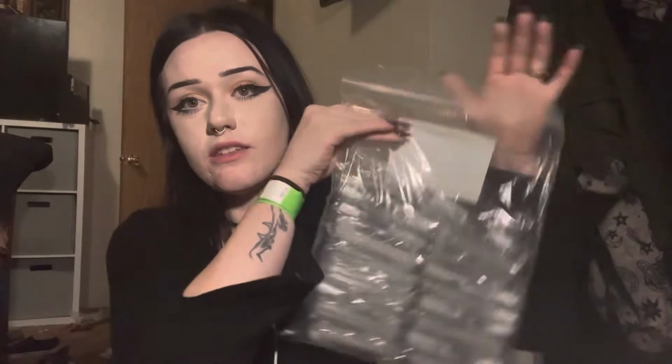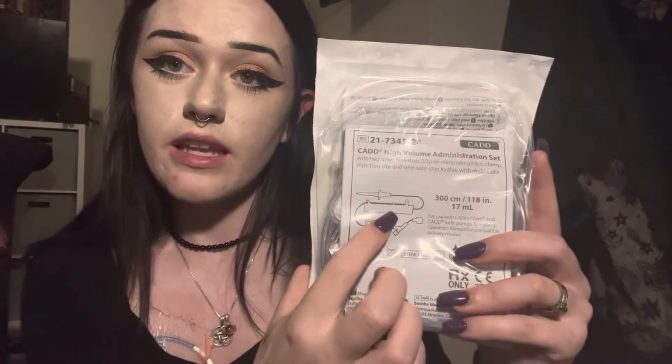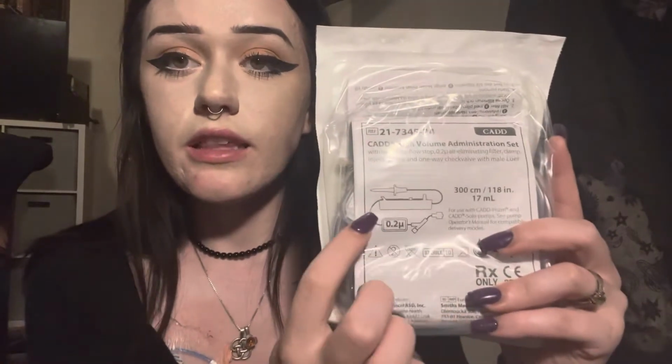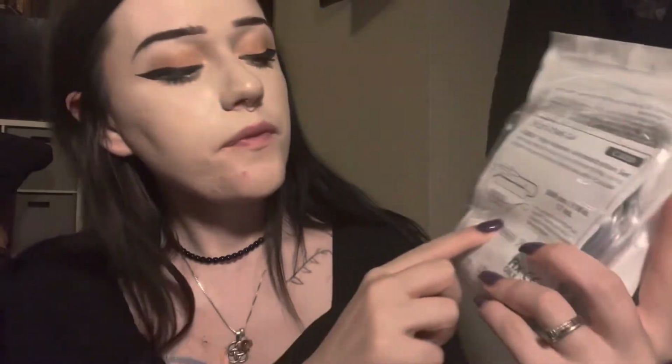And then this is the saline flushes, so I'm just going to put those at the bottom too. And then these are all of my giving sets, which I'm definitely going to have to do some more organization on my cart and figure out where I'm going to put everything. If you don't know what a giving set looks like, it comes in a sterile package like this. This part is the spike that goes in your bag. Then this connects to your pump that locks in. And then there's a really long line, which is 118 inches. And right here, this is the end that connects to me.